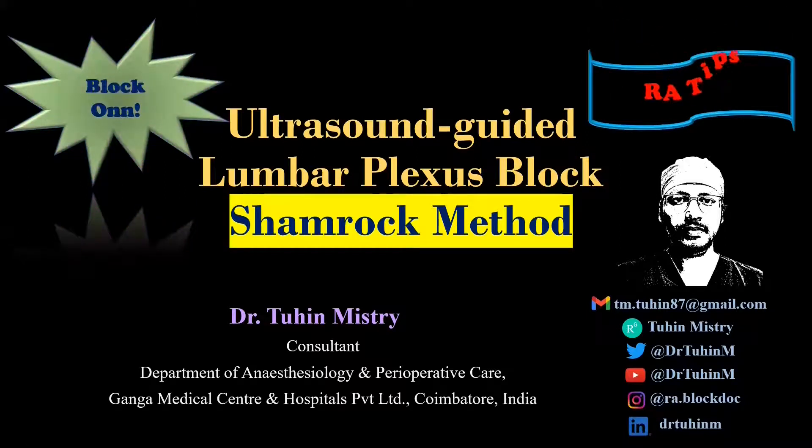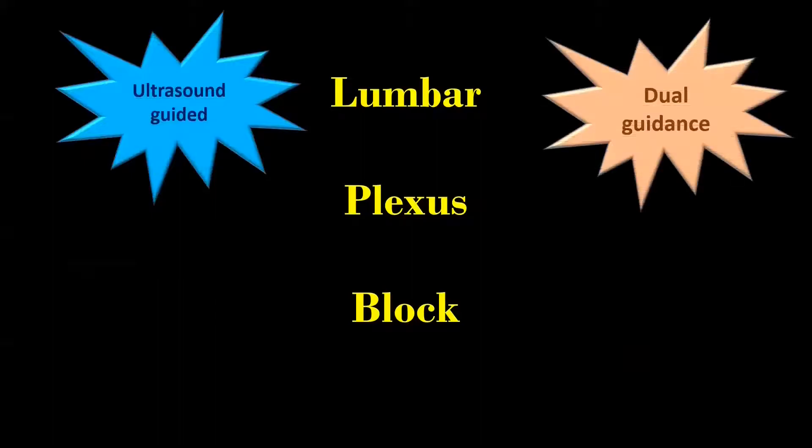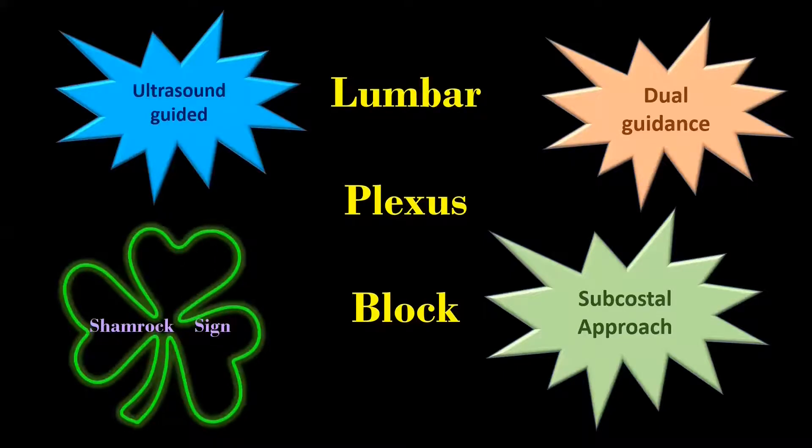Without wasting time, let's begin. In this video, I am going to demonstrate the ultrasound or dual guidance technique for subcostal approach of lumbar plexus block based on the shamrock sign.